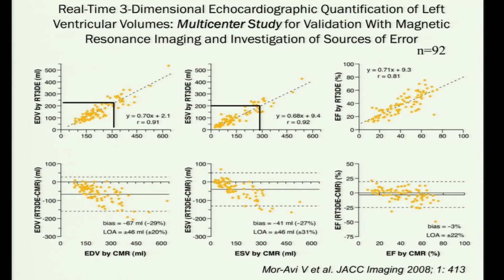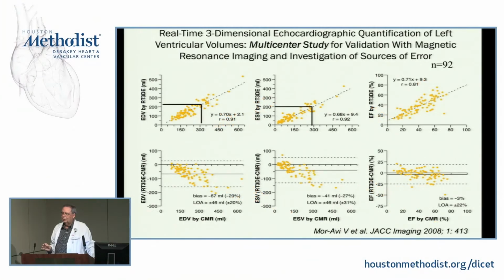It would be great if we could give contrast and do 3D. If that day comes, 3D is going to be dynamite. But it still hasn't come, because when you put in contrast, the systems cannot do a good job tracking those borders. And it goes to hell. If someone can conquer that, and we can do contrast, and then have the computer do a 3D for us, we'll have fantastic data, because the same problem happens.